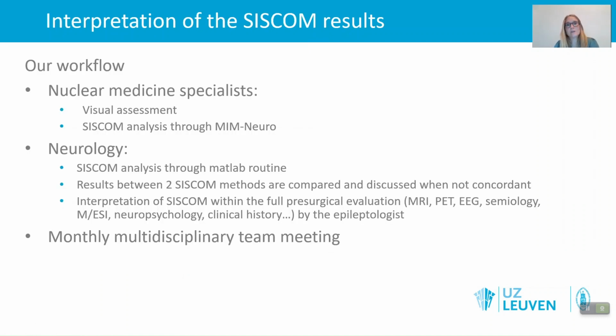Then for the interpretation of the SISCOM results, in our center, the nuclear medicine specialists do the visual assessment. They are trained to do this. They are much more specialized than us to do it. And they run SISCOM analysis through the software package that they are using, MIM Neuro. Then from our side, from the neurology department, I run the SISCOM analysis through the MATLAB routine that I showed you right now.